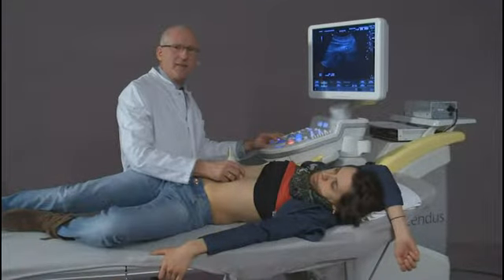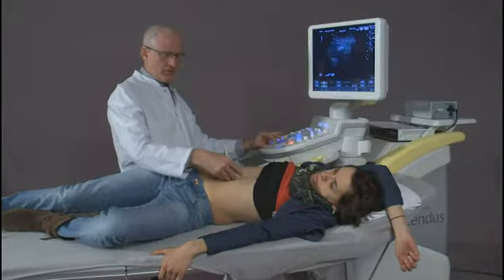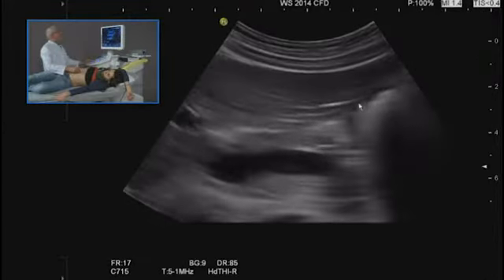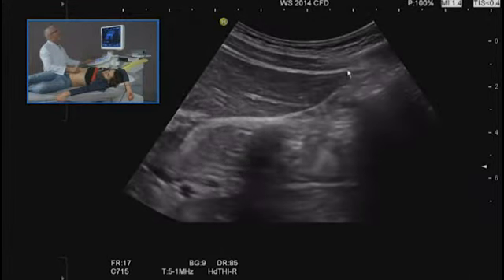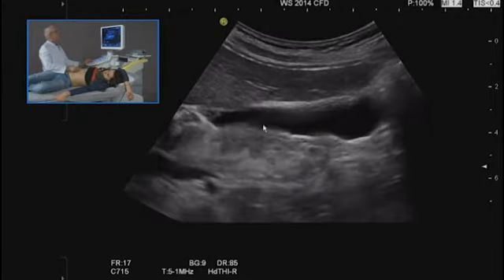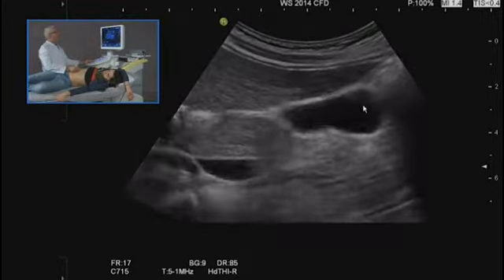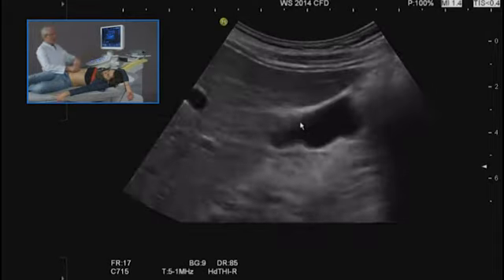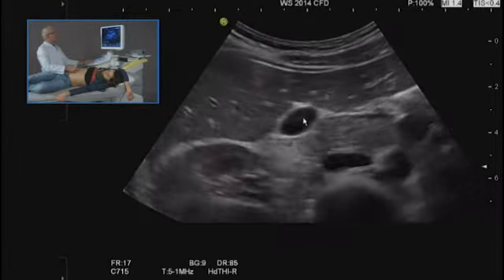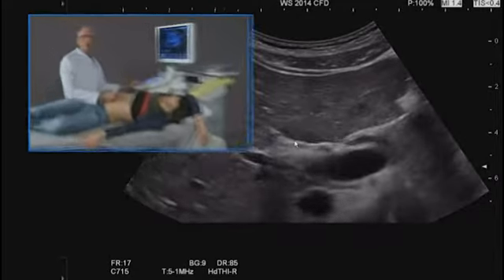The gallbladder can be best examined via subcostal approach. From a median position, take a deep breath. We orientate under the lower surface of the liver, see the arrow, until we can delineate the gallbladder. You can nicely see the gallbladder in a longitudinal plane and transversal plane for evaluation of the whole volume.